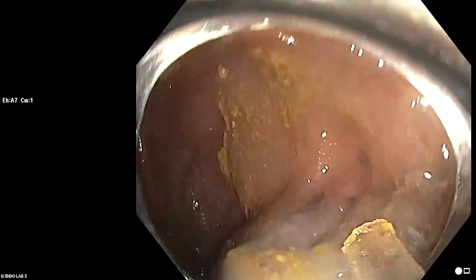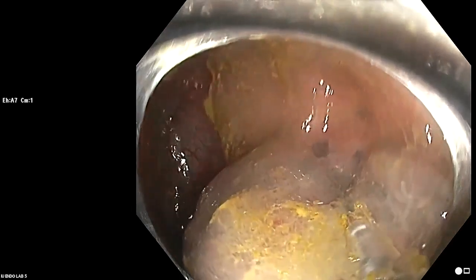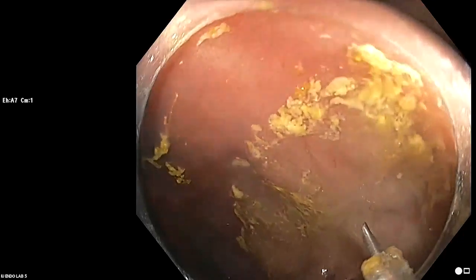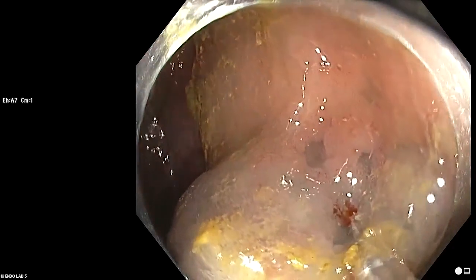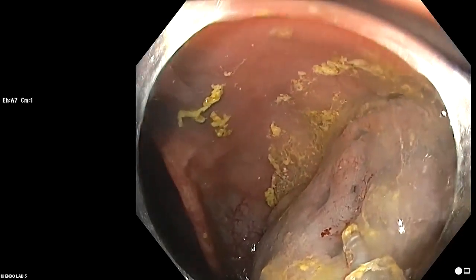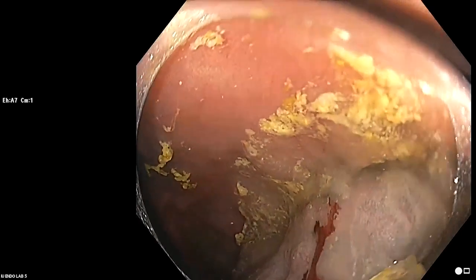So we will move over now toward those weird little divots in there, needle in. As we continue the injection, we're just going to utilize our mound. We've got this nice big mound of fluid. So rather than start over, and especially right here where we're completely on top of the mucosa, we'll just extend by going in, inject again, John. We'll just extend and push the mound up toward the other end of the polyp. And as it goes, we'll pull the needle out, and we'll go there again. I'm sorry, John. Let's get checked one more time.